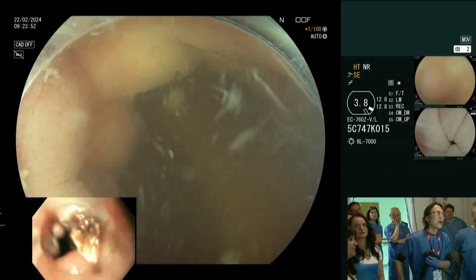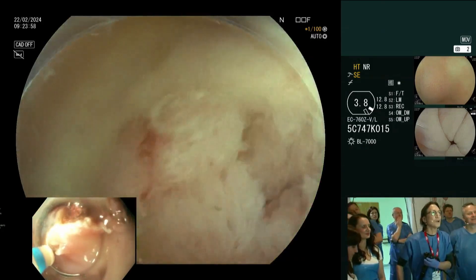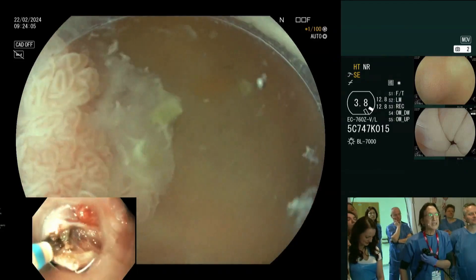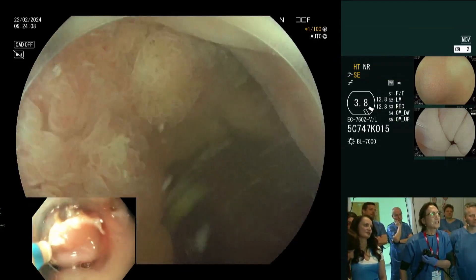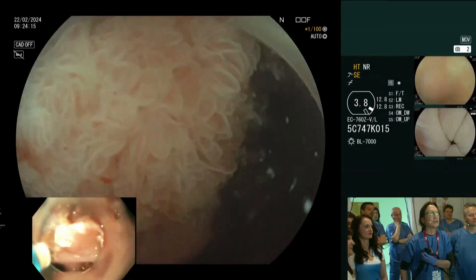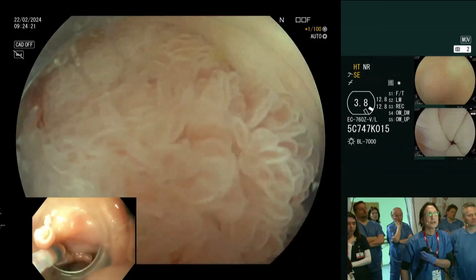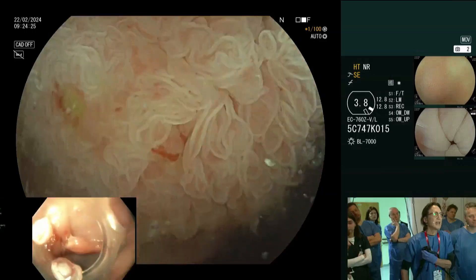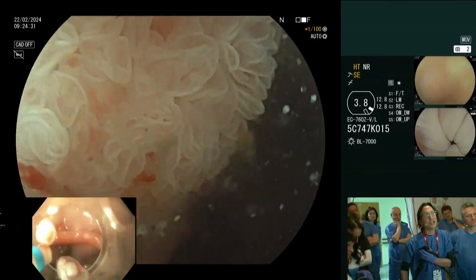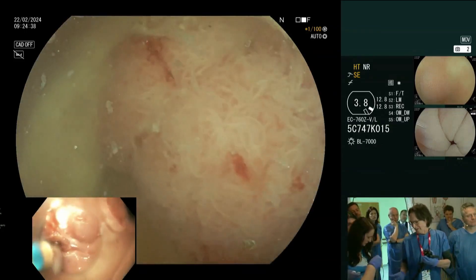Everybody is anxious to see the lesion — so this is the lesion. See how it beautifully floats here? You saw the image on the introduction — that was with gas, and it looked much, much bigger. But this is floating in the lumen. I think we can get this out with a 33 snare. You can see the villus pattern here. It looks like a Kudo 3L, maybe a 4 — definitely branched villi. What I look for is homogeneity — it's very villous, so it's very vascular. That's important.